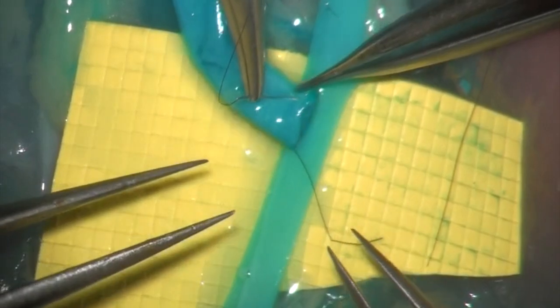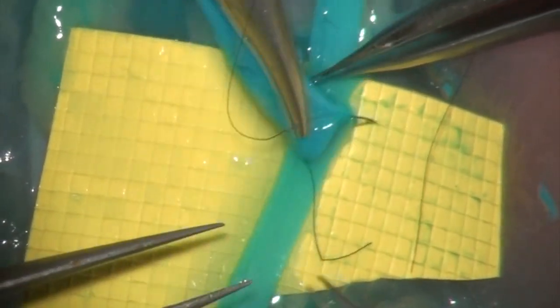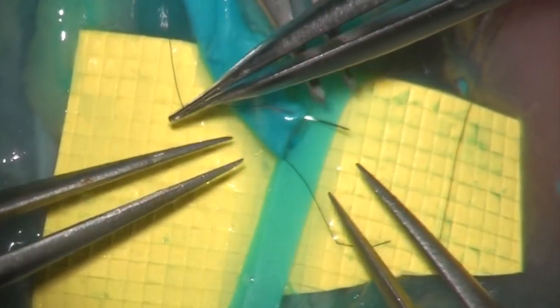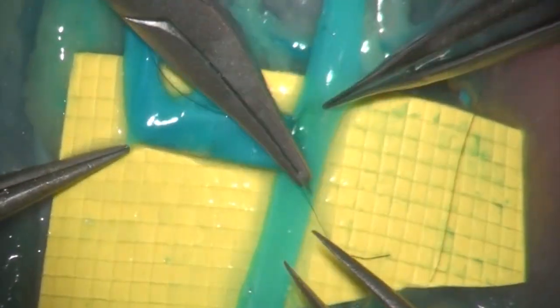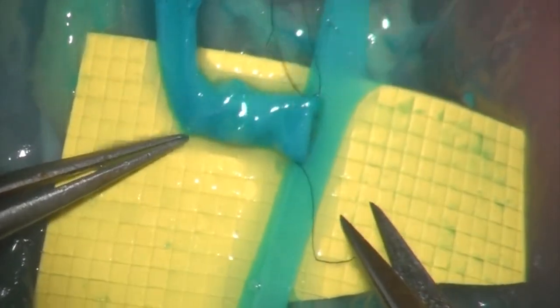The rest of the back wall sutures are thrown in this fashion until the surgeon reaches the 180-degree position closest to him or herself. This suture is then thrown first into the donor vessel, then the recipient vessel in the forehand.